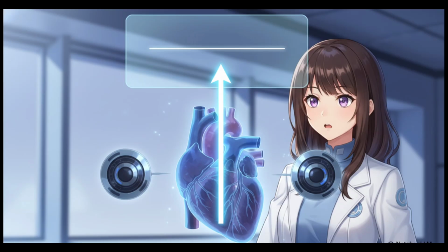And this brings us to a genuinely wild fact. If the electrical wave travels completely perpendicular to our electrodes, the line stays flat. It hides the activity entirely. Seriously, think about that. You could have a massive wave of electricity firing straight up through the heart tissue, but if your positive and negative electrodes are placed horizontally, the machine registers absolutely nothing. Zero deflection.